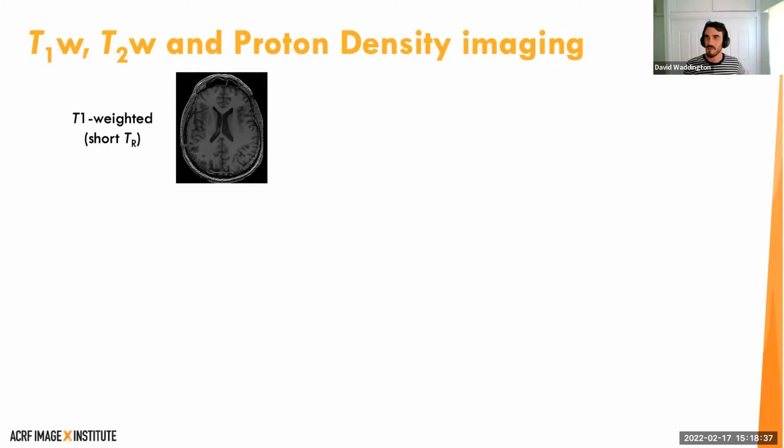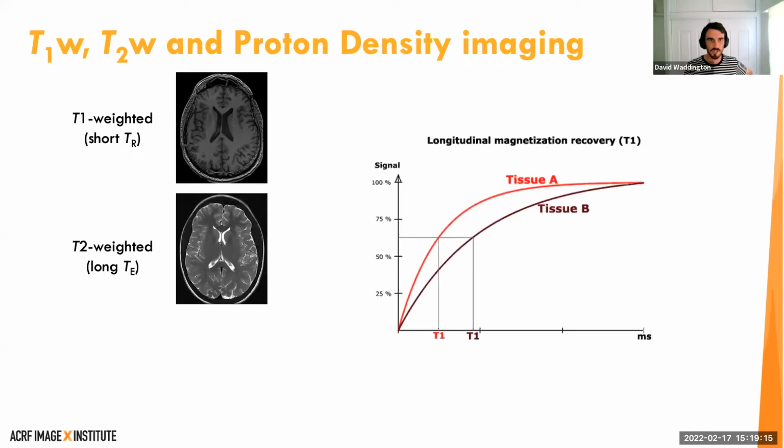Now, again, coming back to what does all this mean in the clinic? I probably should have said this at the start, but if there's one thing I would like you to take away from this, it's some idea of what T1, T2, TR, and TE are and why they matter. The T1 and the T2 are the times that characterize the nuclear spins in your body. And then the TR and the TE are the repetition time and the echo time, which we can configure on the MRI scanner. Across those 4 parameters, by changing and tuning them, we can get all sorts of different images.